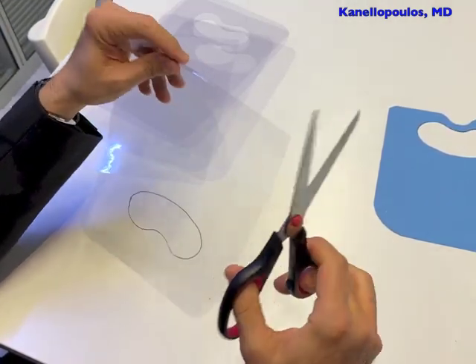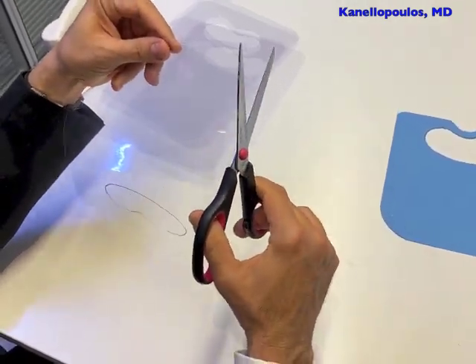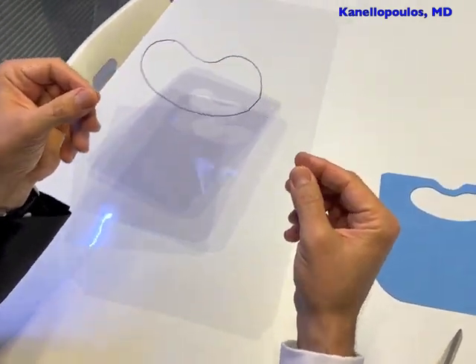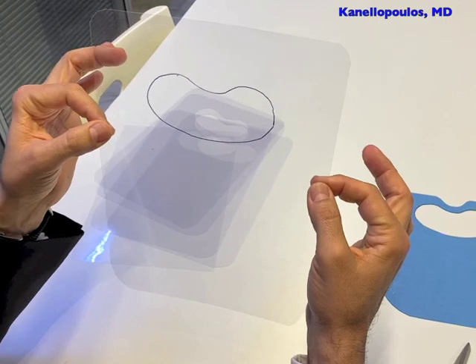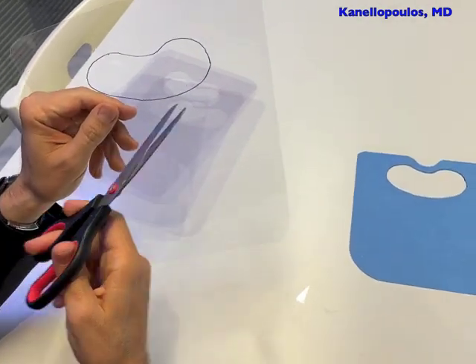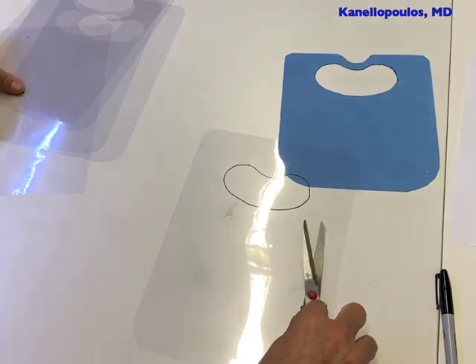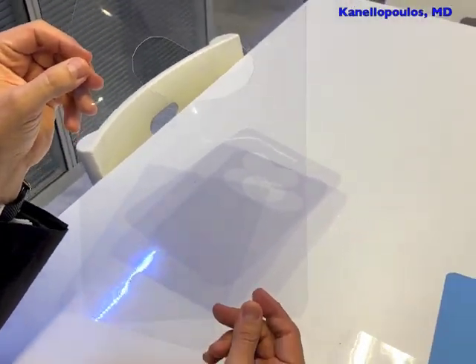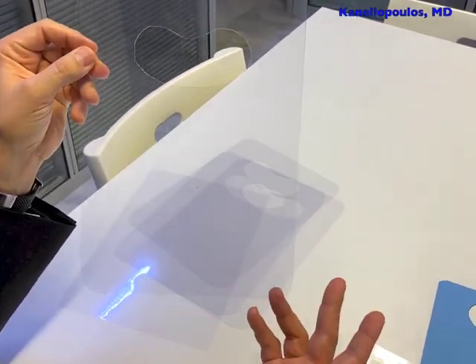This is kind of fun to do. So now we have a well-rounded edges, clear cellophane sheet. Then we'll enter with the scissors in our dead center and carve it around to end up with your perfect end product. This is it — it takes just a few seconds. And that's all you need to do.